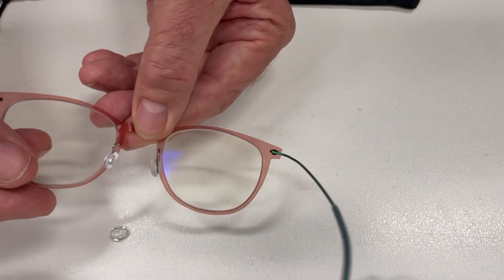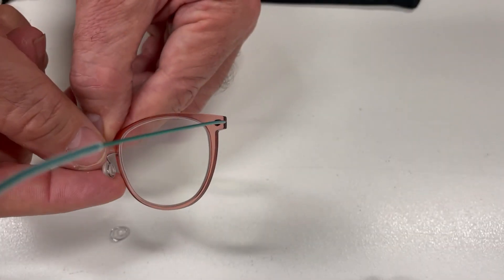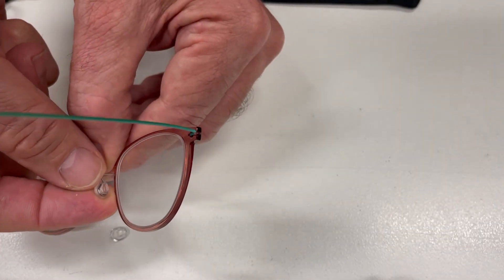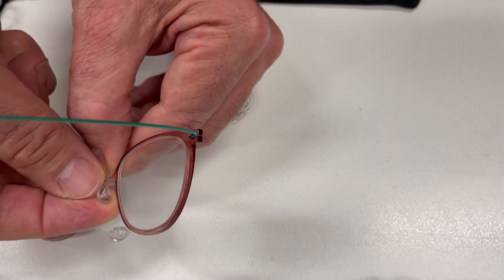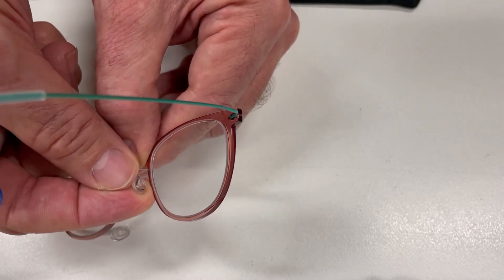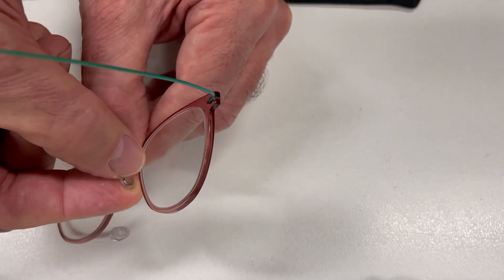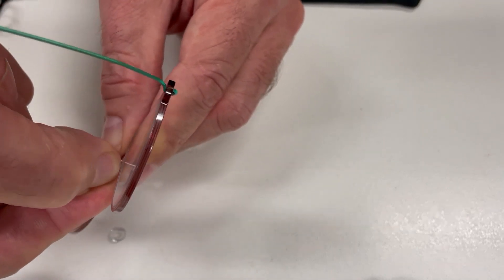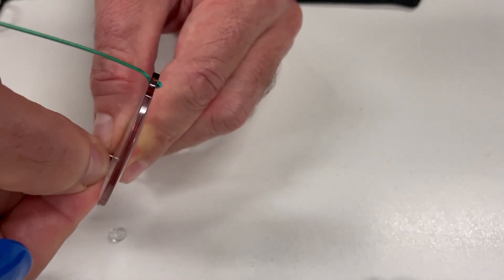To remove the old pad, we need to use a fair bit of force and push the thinnest part of the pad, which is actually the top, up through the wire. It'll stretch the wire a little bit. That's okay at this stage.